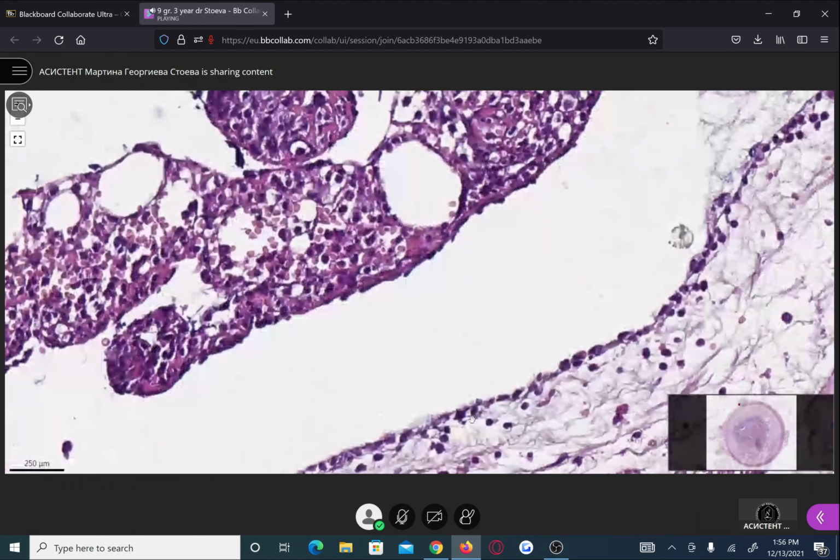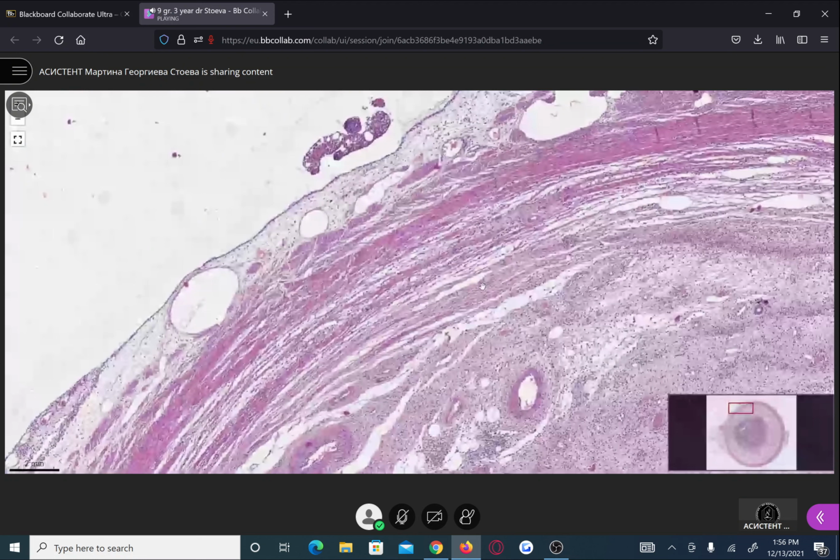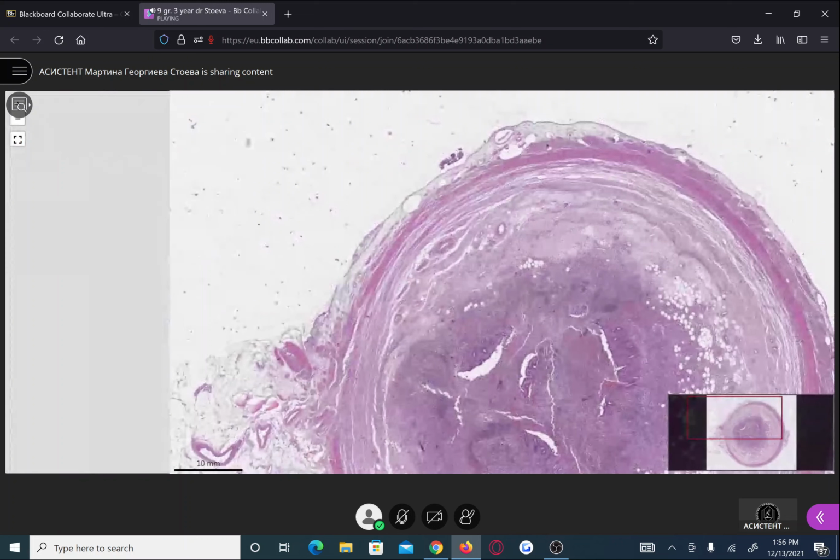This means that this is acute inflammation, of course, when we have such diffuse infiltration by neutrophils. You know that acute inflammation is associated with polymorphonuclear cell infiltration, while chronic inflammation is associated with mononuclear cell inflammatory infiltrate, where lymphocytes and plasma cells are the mononuclear cells.